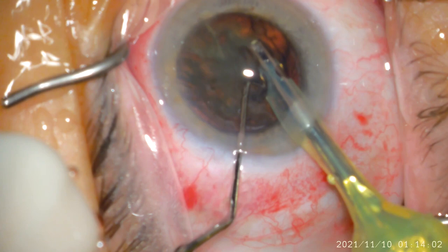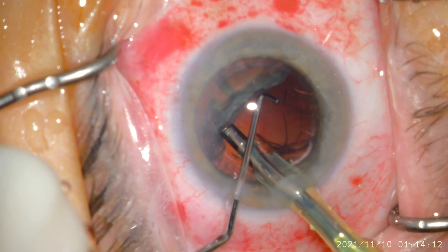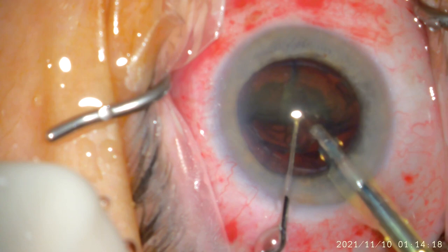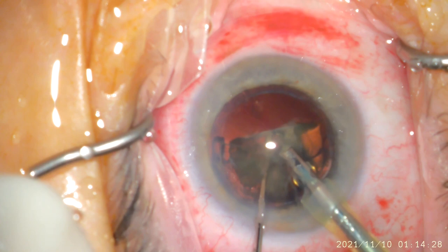In this case, I am removing one half of the lens at a time. Now I am bringing it up to the FACO handpiece and I am aspirating it in its entirety. I am now going to focus on the chopper instrument, which is in my second hand, and I am orienting it so that I can move the pieces towards me and also keep the posterior capsule layer of the eye from coming up towards the FACO handpiece and being torn. This makes the surgery extremely safe.